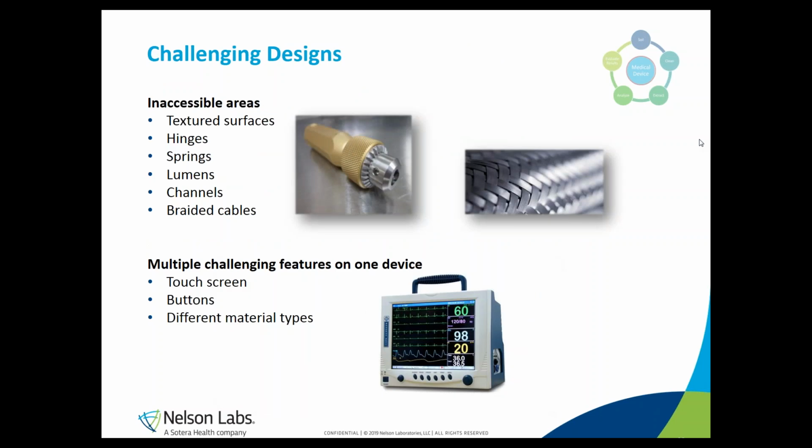If you are designing new reusable devices, you should realize that some features that are incorporated in medical devices can later on be challenging to clean. And some examples are given on this slide. For example, any textured surfaces can be very challenging to get cleaned. Debris from a surgical procedure, such as blood, for example, can stick on these devices and surfaces and dry into all small slits that are present. And the same problem you might have with, for example, braided cables.